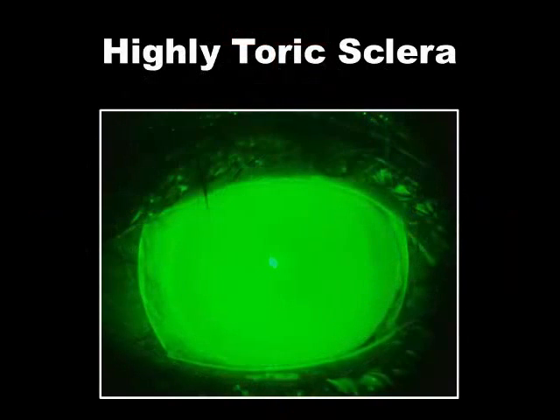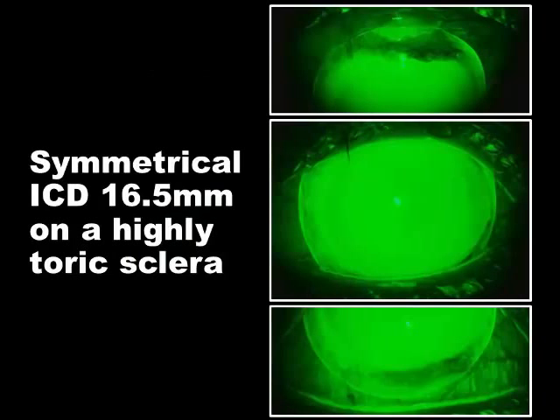Now when you look at this particular fluorescein pattern, do you see anything wrong here? What we don't have is the lens actually landing at 3 and 9 o'clock. It's completely vaulting over top. So this patient must clearly have a very toric scleral shape, because it's not common to place a lens on eye and not see it almost instantaneously seal itself 360 degrees around. And here was the problem. This patient had a highly toric scleral shape.